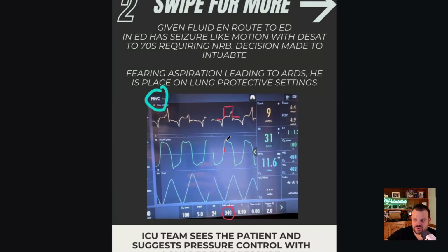So it looks something like this, very crudely, because I'm drawing with the mouse, and then we cycle off into expiration. Your volume should look like an exponential rise, because the most flow and volume happens in the beginning of the breath because the pressure differential is the biggest, to some number, which in this situation would be our set tidal volume, and then into expiration.